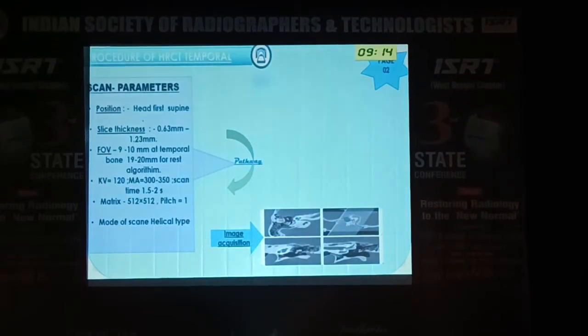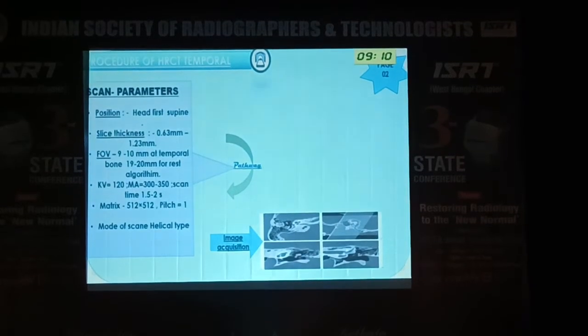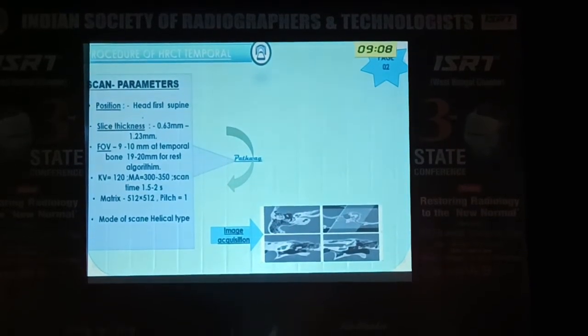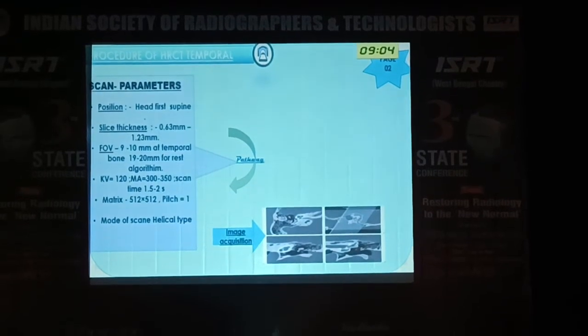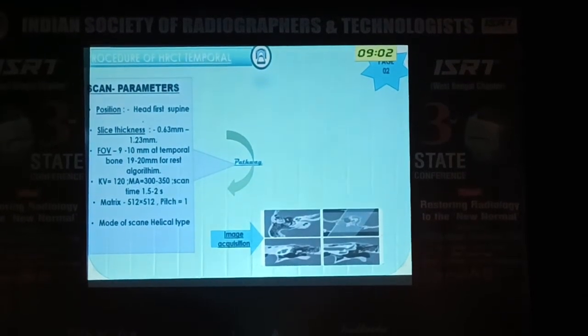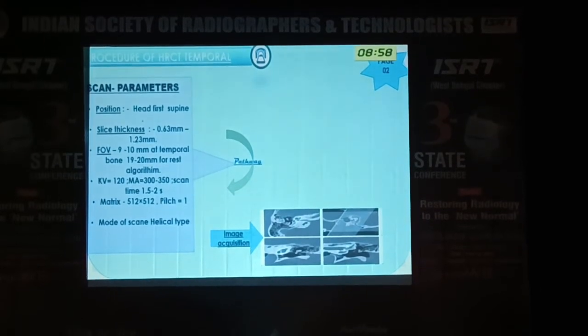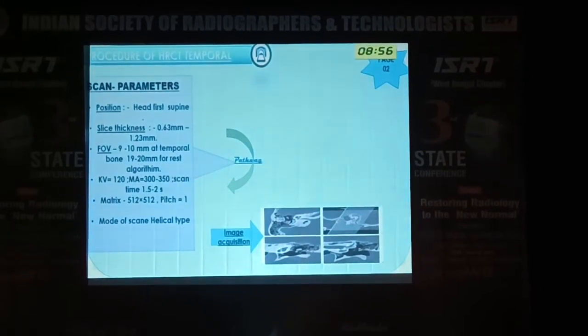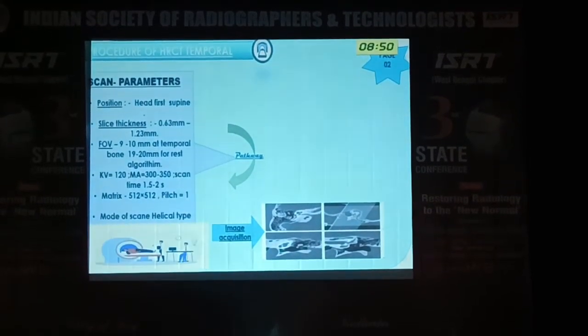That's why we use thin slices. As far as CSOM is concerned, the rate of erosion changes in every slice, from hypotympanum to mesotympanum, then epitympanum. There are multiple parts that we have to look for. So erosion in that case will create changes for further diagnosis.